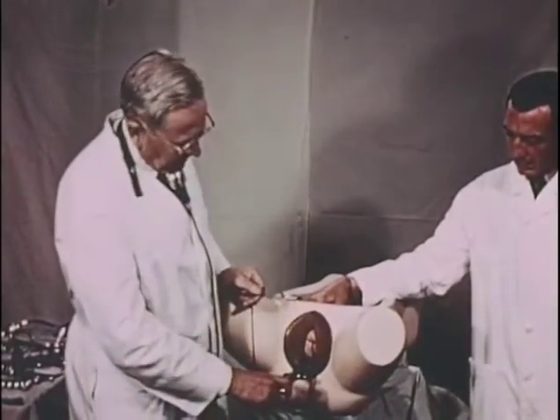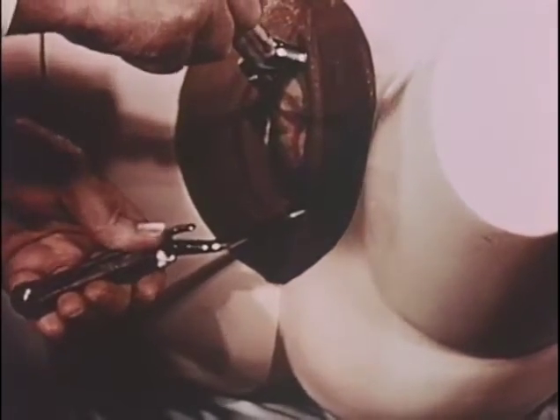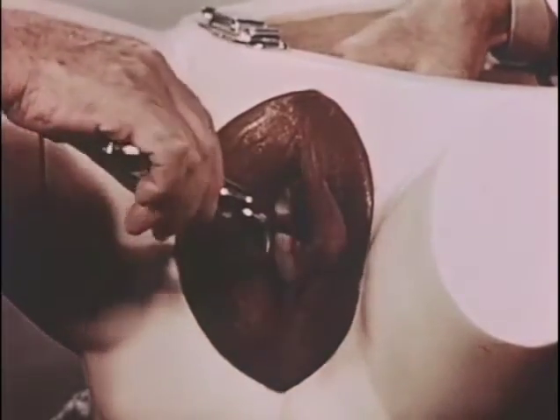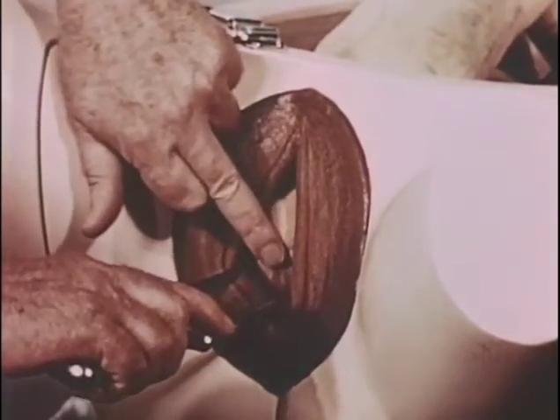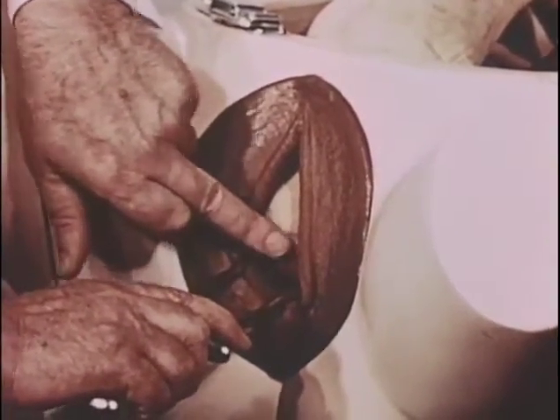This correction is rather easily made. Unlock the handles, elevate one at a time, top one first, up to the level of the posterior fontanelle. Hold it, then elevate the handle of the posterior blade up to meet it, relock. Then compression of the handles with depression of the head end. There's a slight shift. Some slack is allowed for so that the resultant is the posterior fontanelle, a finger's breadth in front of the plane of the shanks.